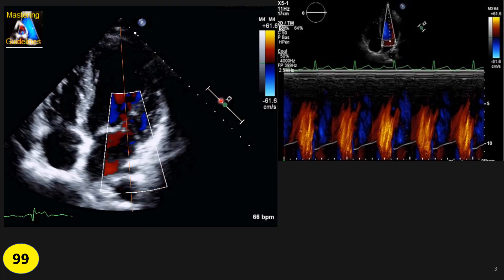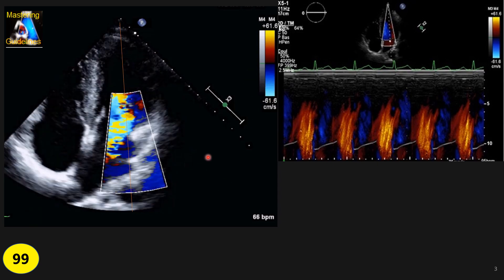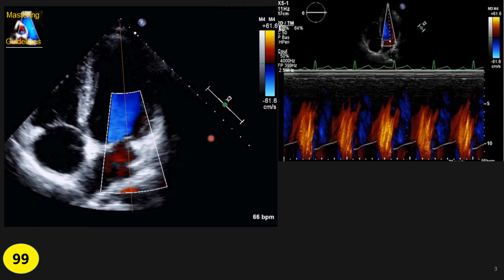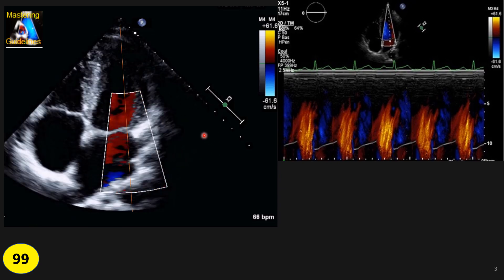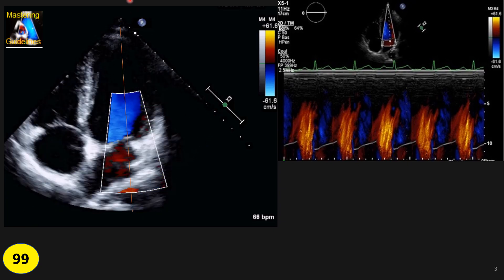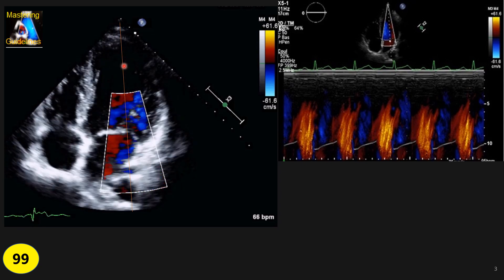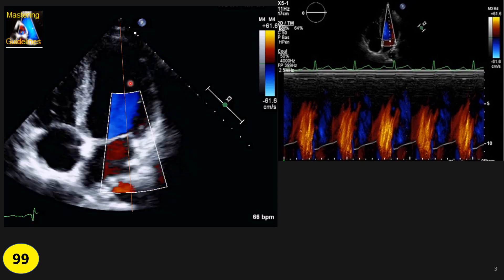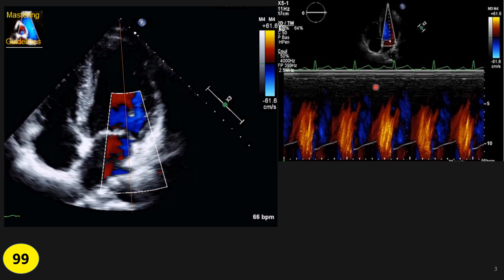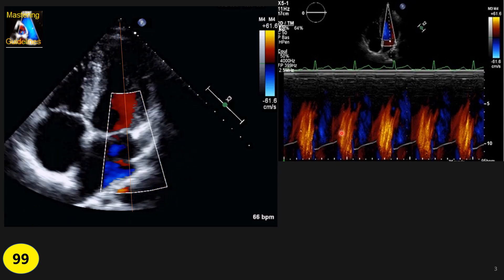For the VP technique, first we go to the apical 4-chamber view — I'll briefly talk about the TEE approach as well. We optimize our image depth, color, and everything, then place the cursor exactly at the direction of the color flow inflow to the LV. Then we hit M-mode, which shows us a combination of 2D — you can see the mitral valve with E and A waves covered by color.